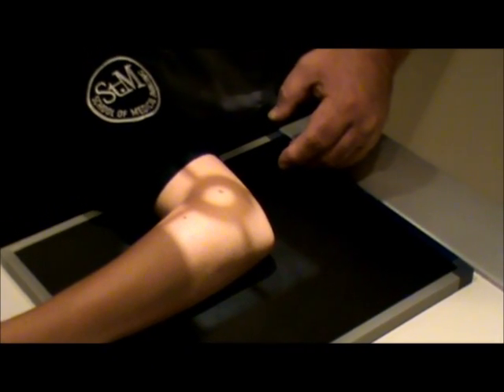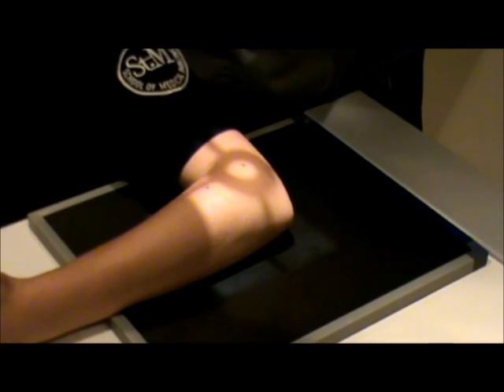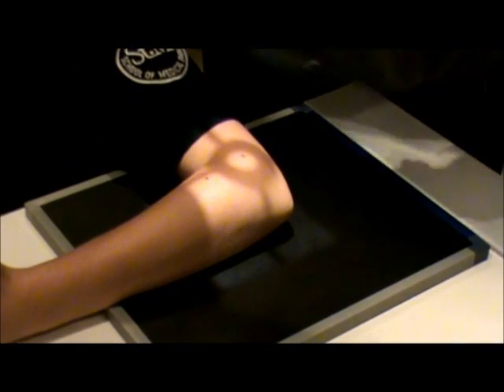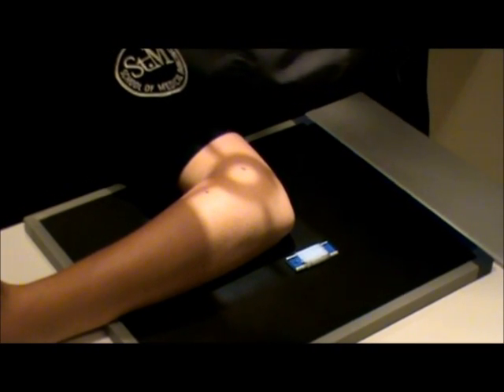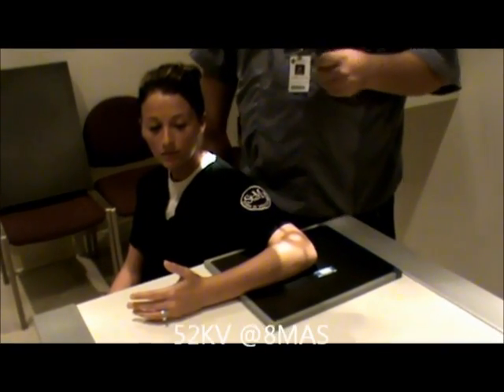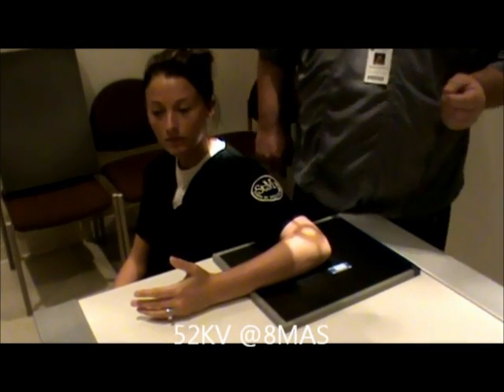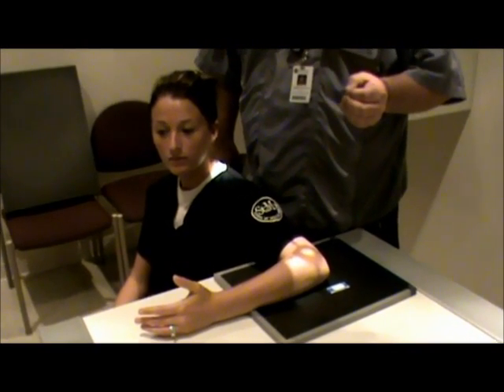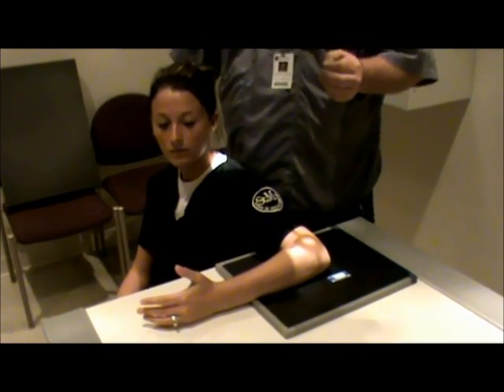This will put the olecranon in profile and also show the fat pads. On this view, when you look at the image itself, it will show the three concentric arcs, which is an indication that it is a good true lateral. We want to make sure our marker placement is not obscuring any pertinent anatomy in the light field. Technical factors change a little bit — it goes to 52 kV at 8 mAs. The reason behind this is that if we increase the technique or leave it the same, it does tend to burn out the olecranon process. This is our lateral elbow view, and these are our elbow views. Thank you.